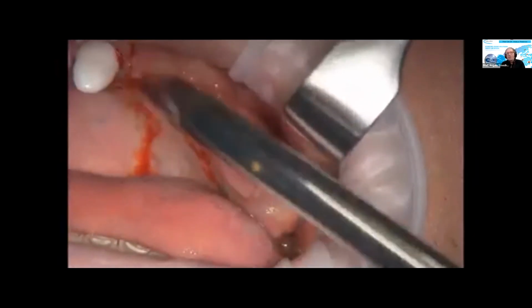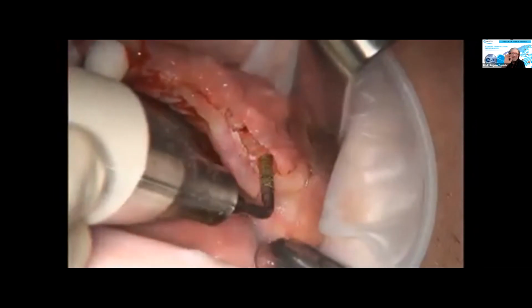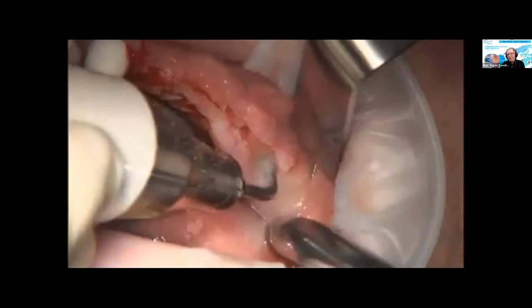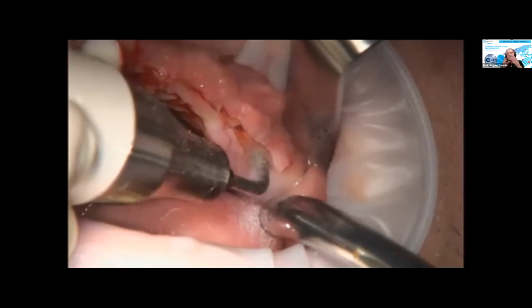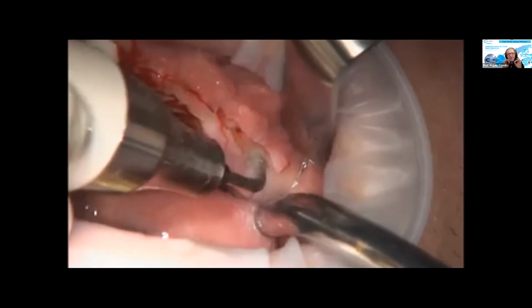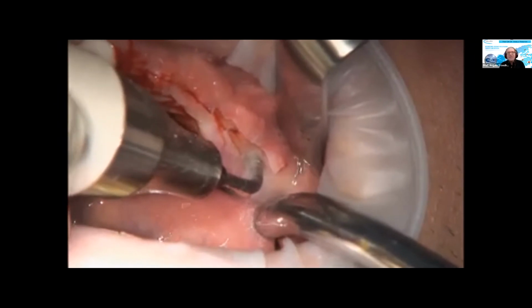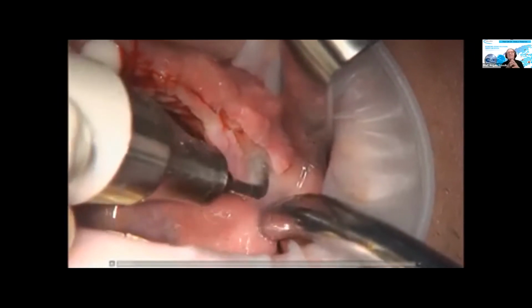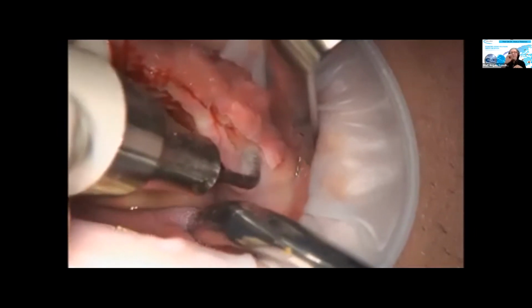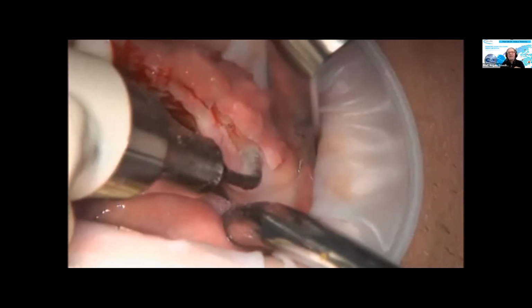And since we know we want to insert 2 implants, we start always, and please, this is very important, because I already know that maybe afterwards in the chat you will ask the question, but can I do it via 2 holes? No, the very, very beginning of the INTRALIFT is only by 1 single hole. Of course, you see a second hole here, but this second hole was only the marking of the placement of the implant. The real INTRALIFT we do only by 1 single transcrestal approach.